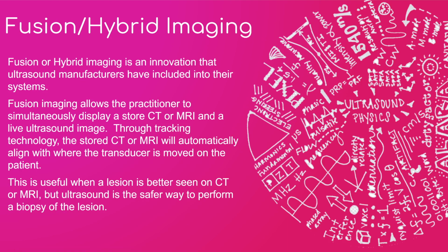Another thing that we didn't talk about is a newer innovation that is being integrated into ultrasound machines. When you buy an ultrasound machine from Philips or GE, they have a very basic package. You can ultrasound with it, and you can maybe measure a couple things. And then if you want to do more specialized things, you buy packages that get downloaded into the ultrasound's computer drive.